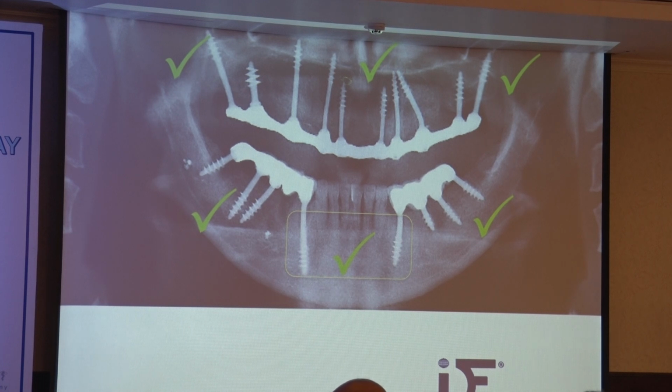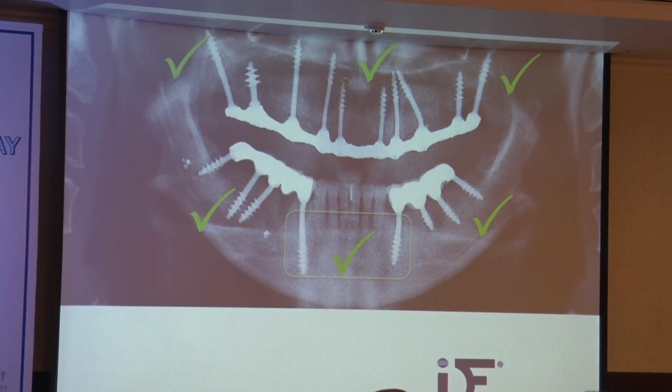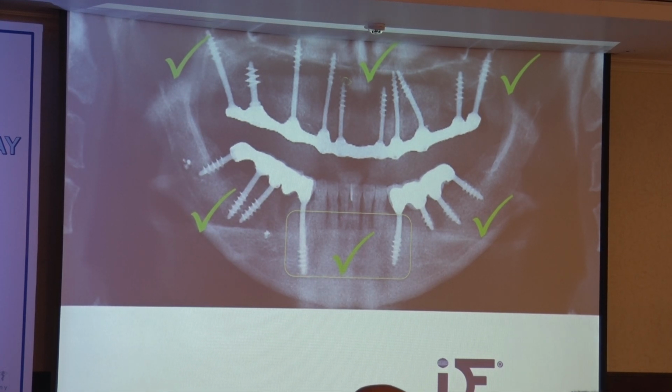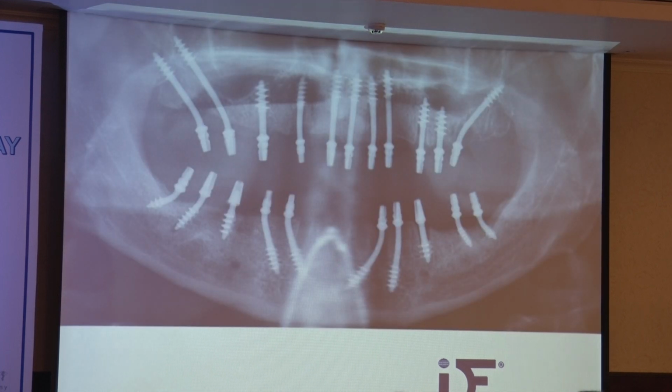Okay, here you have the anchorage between the mentals. Then in the distal mandible you see lingual cortical engagement. The upper implants there, it's not so well structured. As you see, the implants on the laterals in the upper jaw don't reach the second cortical. Sometimes we have a very good bone there. In most cases we don't have good bone. In most cases only for the centrals there is good bone below the floor of the nose, but here this was stable. Another example for treatment.